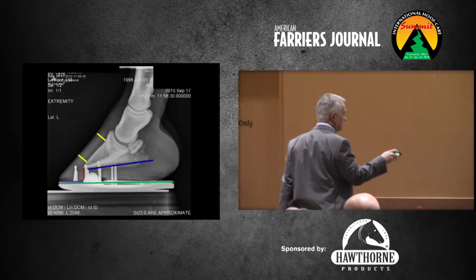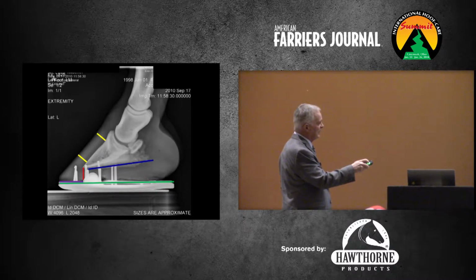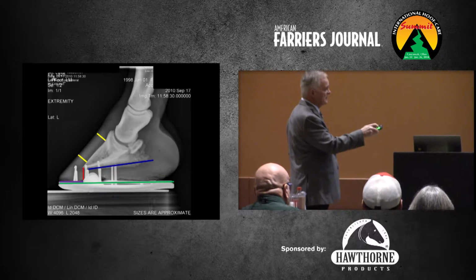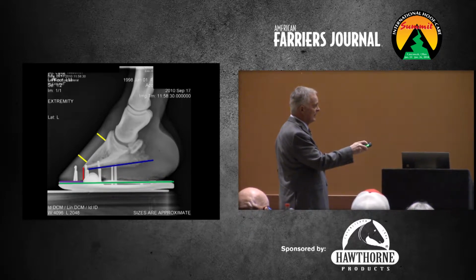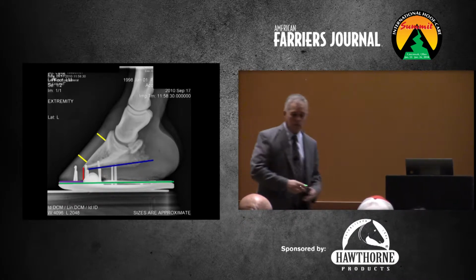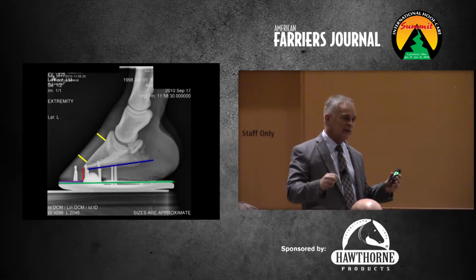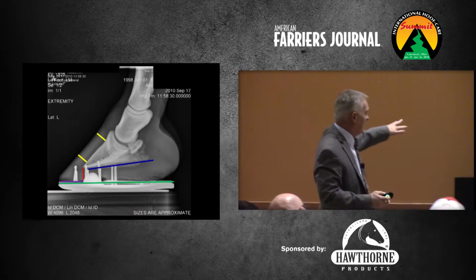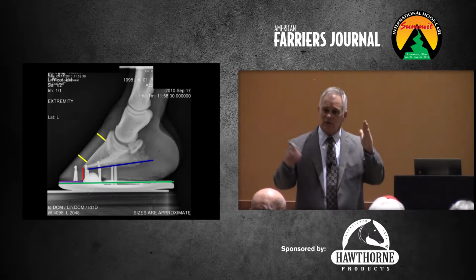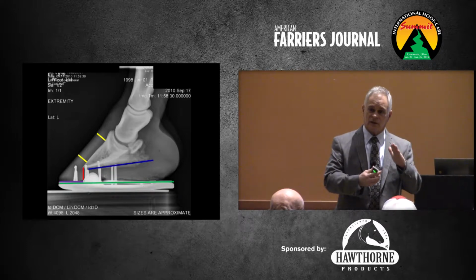So this horn lamellar zone is simply the distance from a point just below the coronet, measured to a flat spot on the coffin bone. You can't come up here where the extensor process is, or it's going to be quite different. But we try to find the flat plane, and then again we come down toward the bottom and measure the same. Now again, we all know coffin bones aren't perfectly flat or straight, so you can't get hung up in all the little variances in them. And you don't need to make this any more complicated than it needs to be. But what we want to see is that those distances are basically the same. And what that tells us, as you learned yesterday, is that basically the front of the coffin bone should be parallel to the front of the hoof wall.